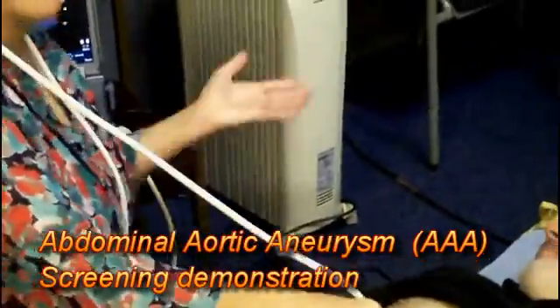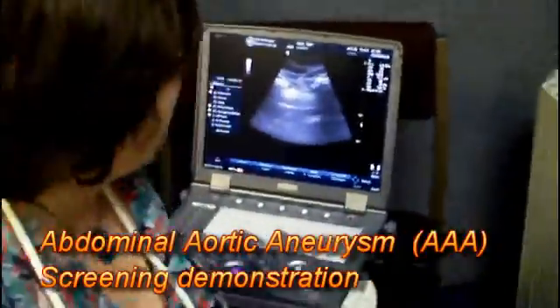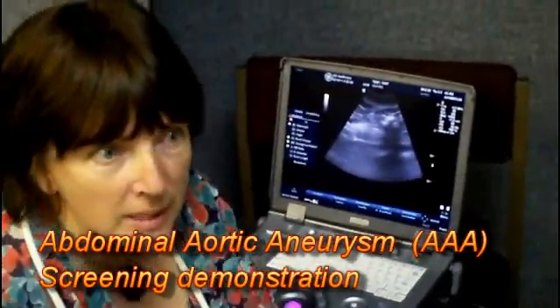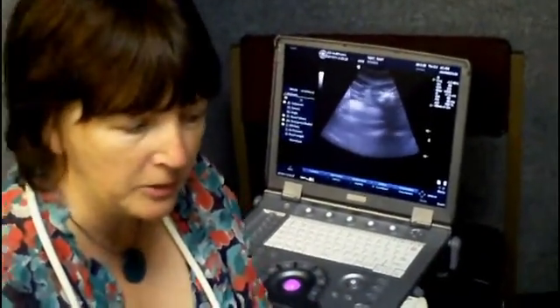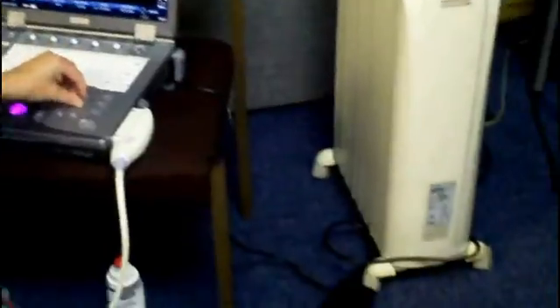Basically all that we're doing is, as you can see, it's a simple scan — there's no preparation needed at all for this, other than just to avoid fizzy drinks and chewing gum, because that creates a lot of gas in the bowel which the ultrasound cannot penetrate.